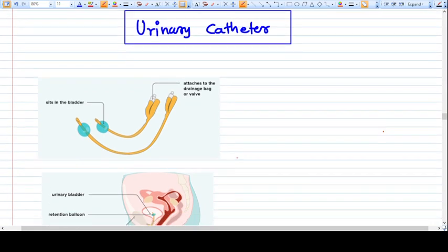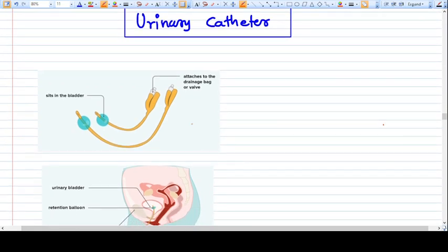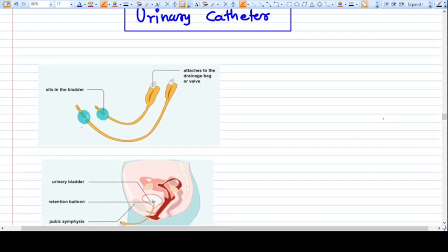Hello everyone, in this video we're going to talk about urinary catheters in depth. You've all seen urinary catheters - they look like this. The most common catheters we use are Foley catheters, which are tubular devices made up of rubber with an inflatable balloon at one end.